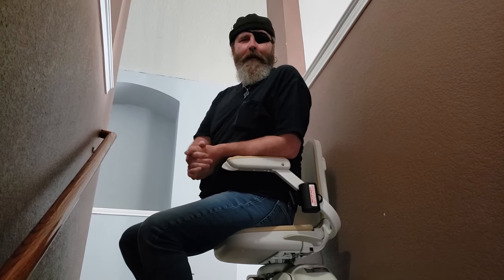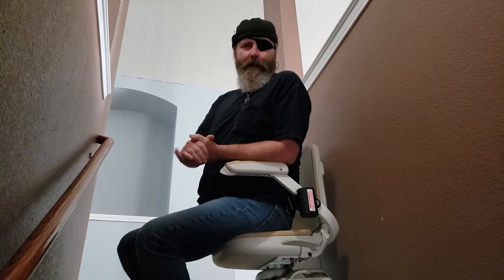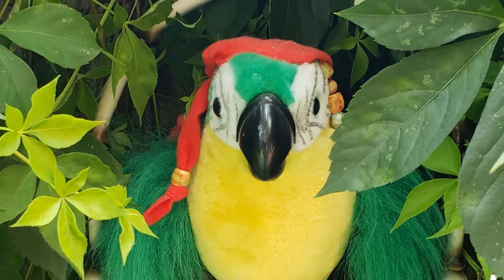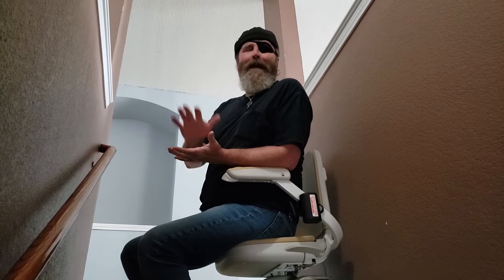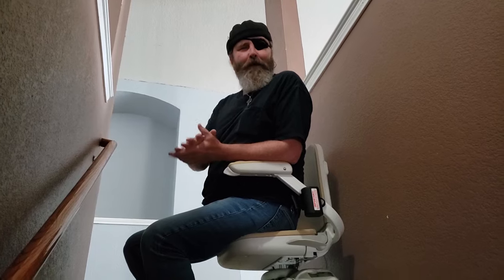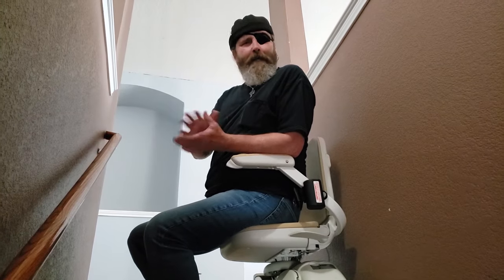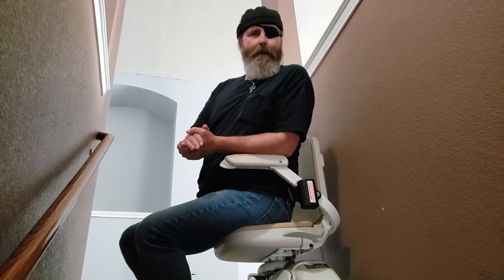So today what we're going to be doing is we're going to be removing an Acorn stair lift. It's kind of a nutty job — let's hope it doesn't get squirrely. This is one of the fun things that I like to do. A friend of ours has one of these that they need taken out, so we're going to take it out doing as little damage as possible.